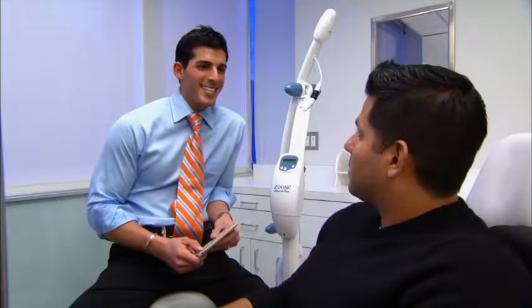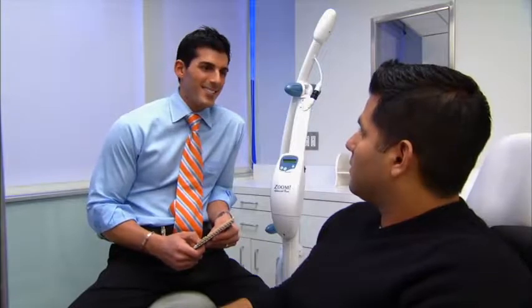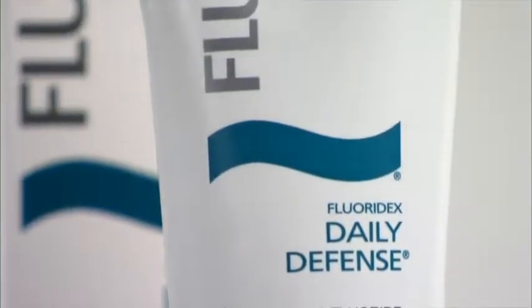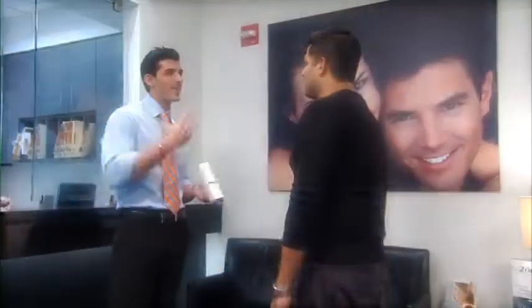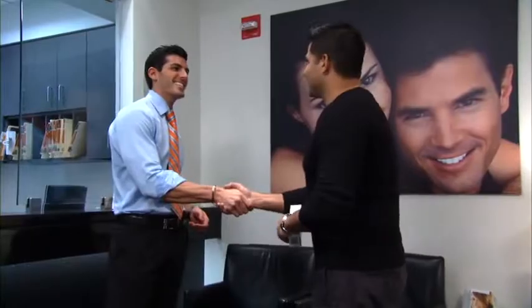You may want to treat existing issues before offering the whitening treatment, and you'll also need to disqualify any patient who is perio-involved, exhibits failing restorations, or is otherwise in an unhealthy oral state. To better minimize sensitivity issues, it is recommended to prescribe Fluoridex Daily Defense Sensitivity Relief or another 5% potassium nitrate toothpaste for use 2 times a day, 10 to 14 days before treatment.